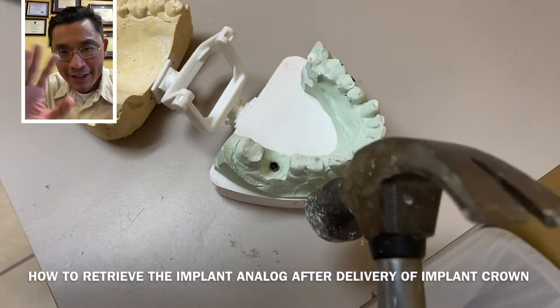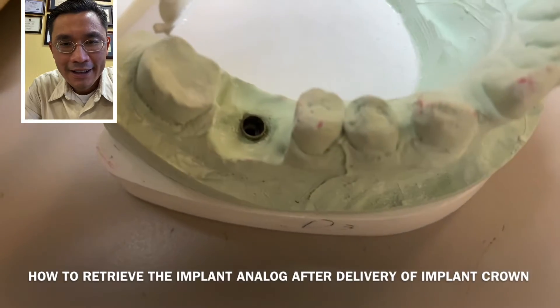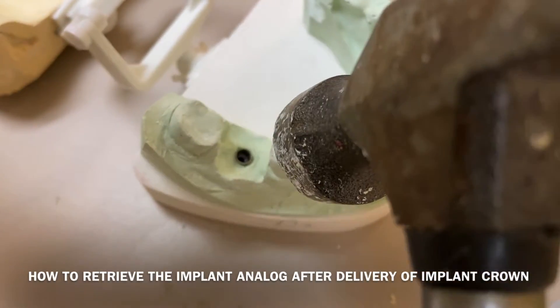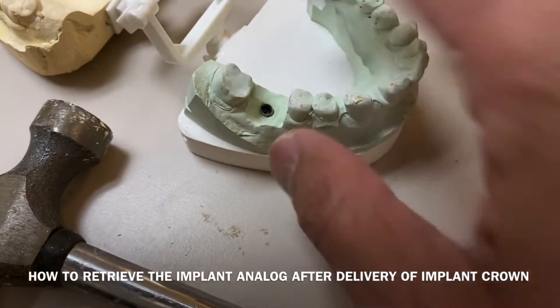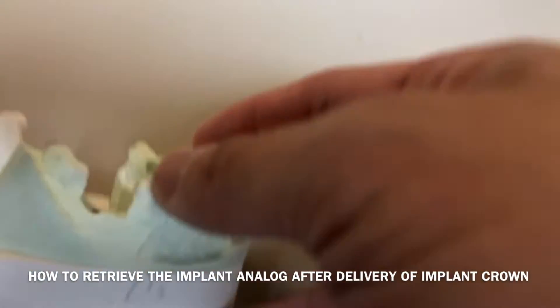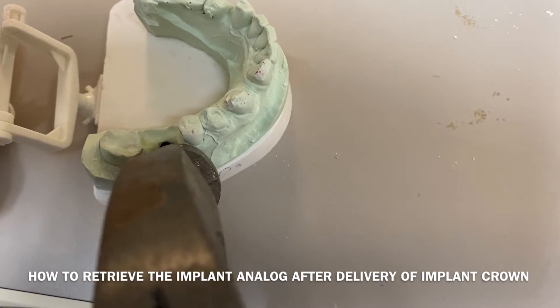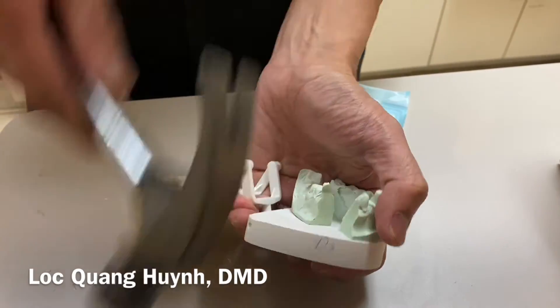Hi guys, welcome back to my YouTube channel. Today I just want to show you how to retreat the implant analog after you deliver an implant crown. This is the case that you can see — there is the implant analog that the lab poured and fabricated the crown.